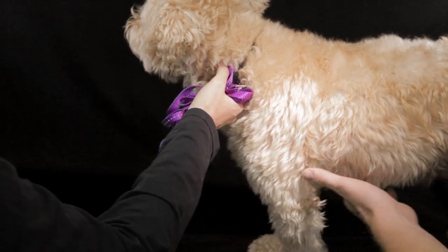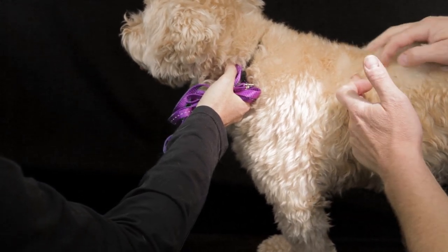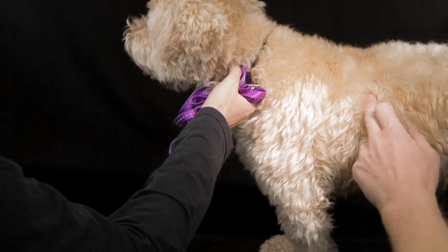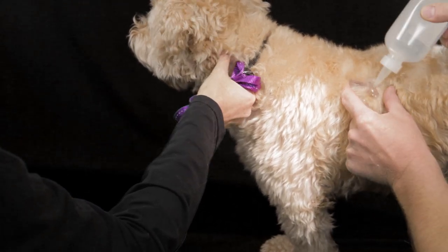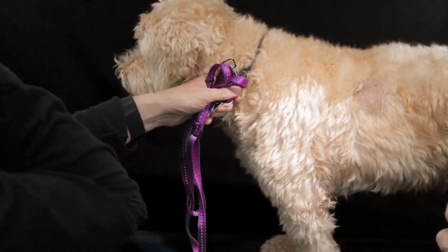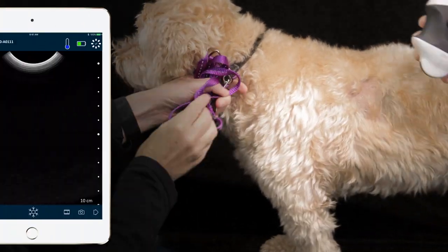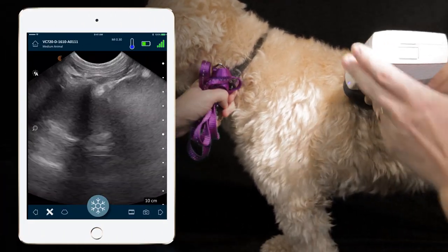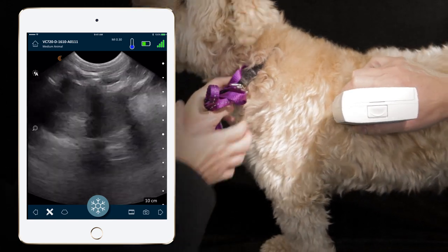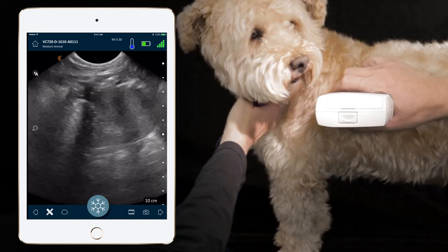The first site when we do the lung ultrasound is very similar to the chest tube site of the FAST exam of the thorax. We essentially find the sub-xiphoid ventrally and move our finger dorsally, or we'll count forward to approximately the ninth intercostal space. Once we've localized that area, we apply alcohol after parting the fur, making sure the marker is towards the head of the patient, and orientate the probe perpendicular to the ribs.